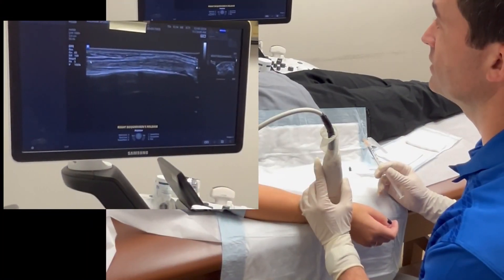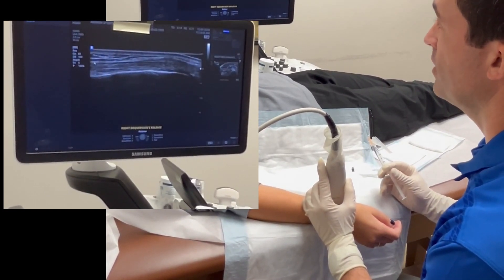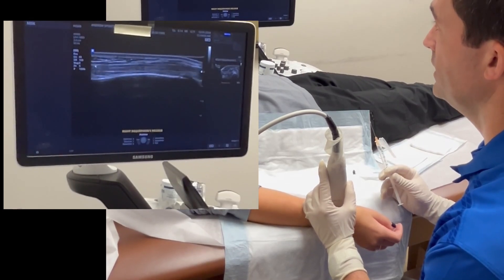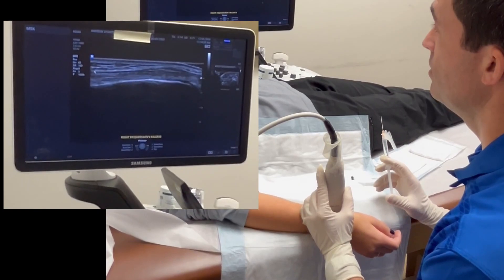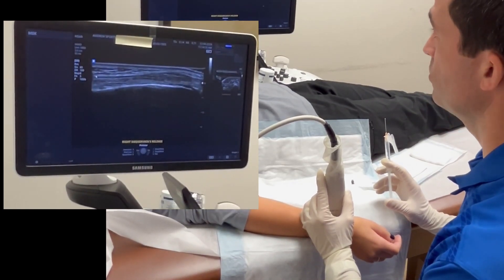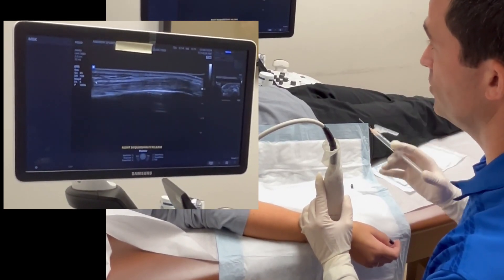I've identified on the left side of the screen the superficial radial nerve as it crosses over the dorsal compartment, and we can see that it's far off from the actual extensor retinaculum, so it's going to be very safe with no risk of injury. We're going to advance a 25-gauge needle with a mixture of three milliliters of lidocaine 1% with epinephrine. The epinephrine will help with hemostasis during the procedure, and we'll advance it in-plane with the probe, injecting over and under the extensor retinaculum through the whole soft tissue.